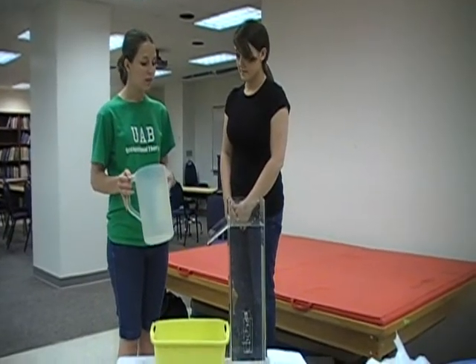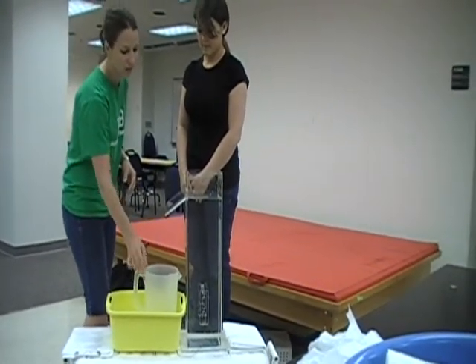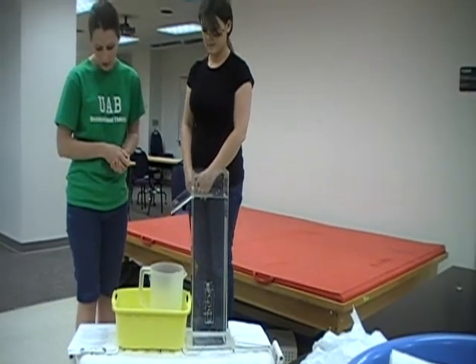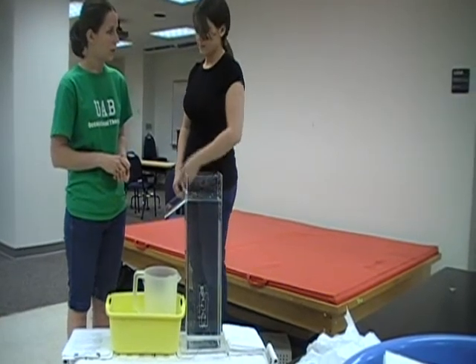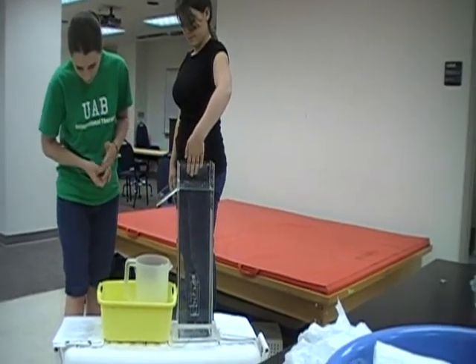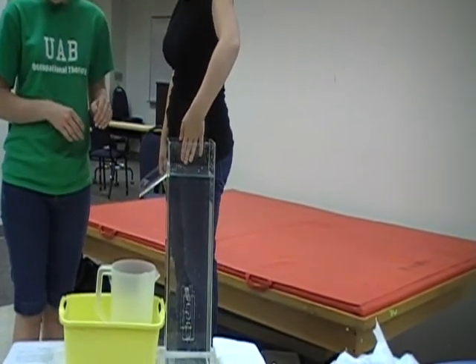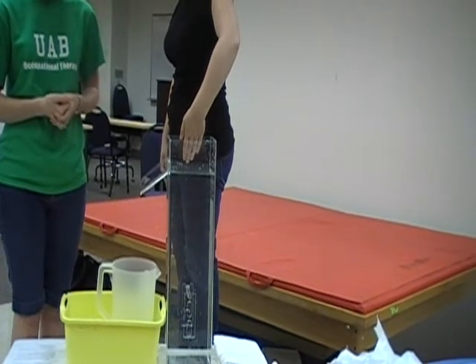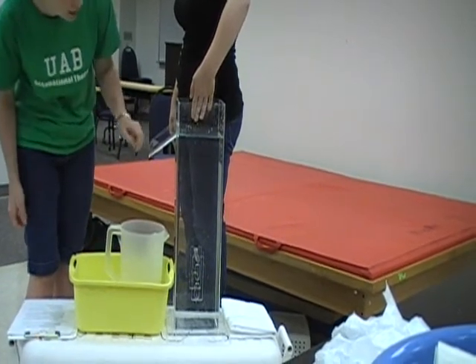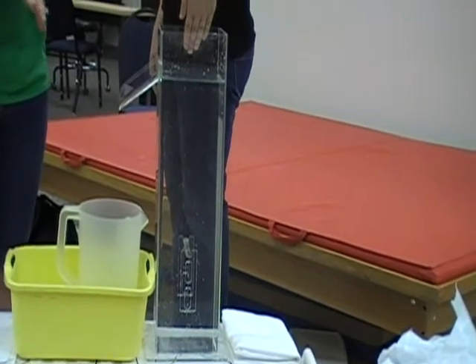Now that we have filled the volumeter to the point of overflow, position an empty container below the spout. Ask your client to position their hand so the palm is facing them with the thumb facing the spout. Instruct your client to keep their hand as vertically as possible and avoid contact with the sides of the volumeter as they submerge the hand, putting their third and fourth digits in between the bar to where it goes to the joint.